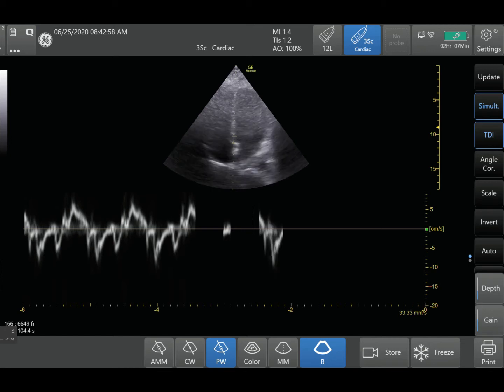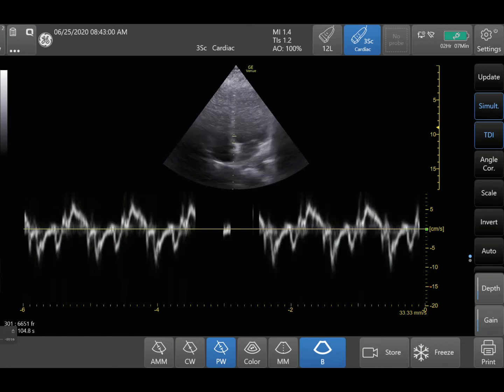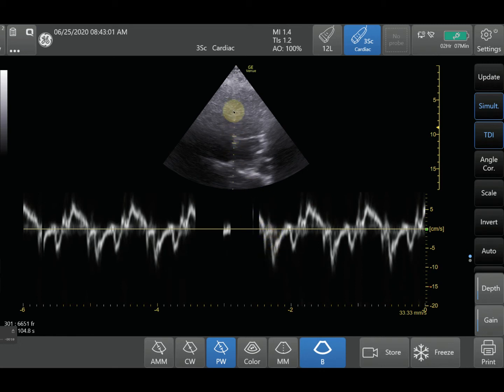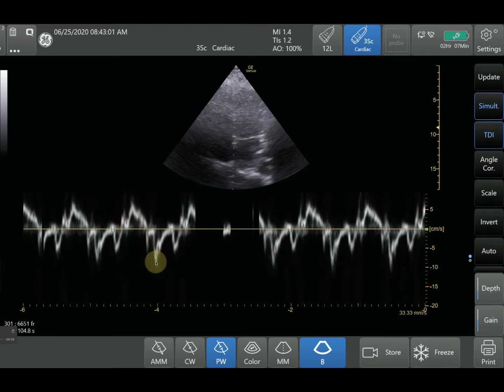So here we've activated it, and right when you activate it, you start seeing a tracing of your Tissue Doppler. This is actually the movement of the muscle as it goes towards and away from your ultrasound probe. And that's what you're measuring here. So this is the S-wave right here, and this is your E-prime, and this is your A-prime over here. The full details of how to interpret all these waves are beyond the scope of this video, but we're just using this example to show you how you can use Tissue Doppler.